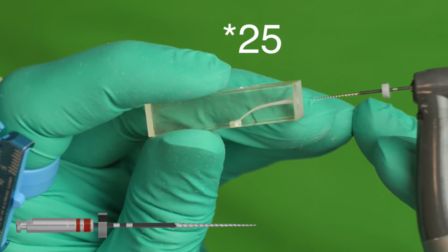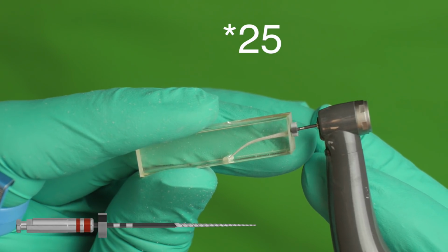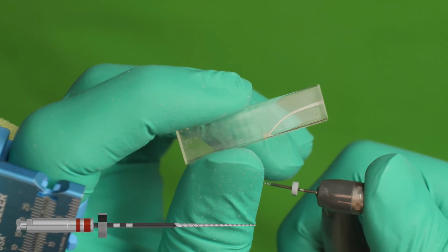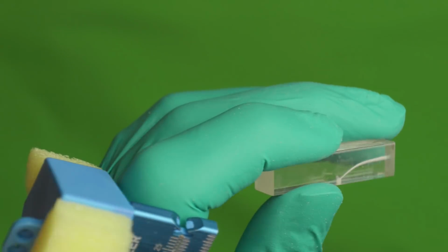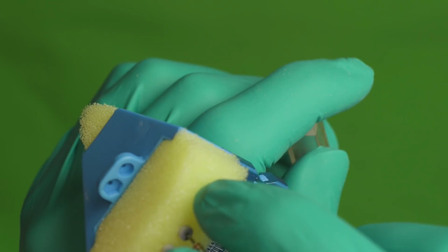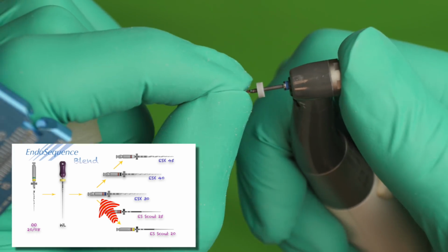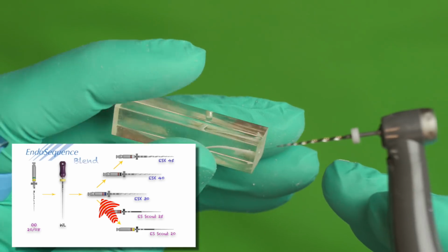So we clean that up, and the 25 is already at the working length. Perfect. So the 25 has reached the working length. And are we going to finish at 25? Well, no, actually. If it hadn't reached the working length within 2 rhythm motions, by the way, we would be moving down in size to a size 20 or even a 17 or a 15. But the 25 has reached the length already, so there's no reason to go any further down in sizes. It would be redundant.